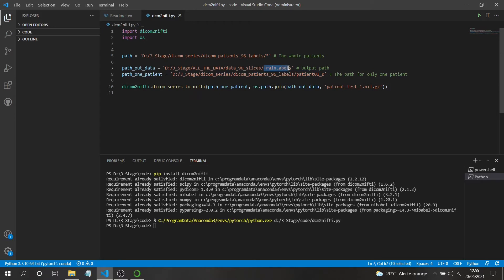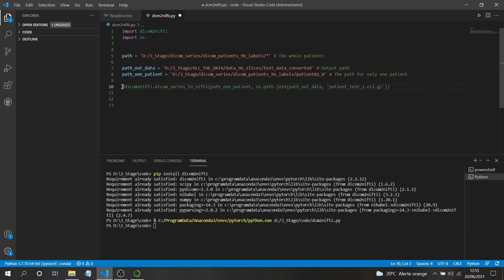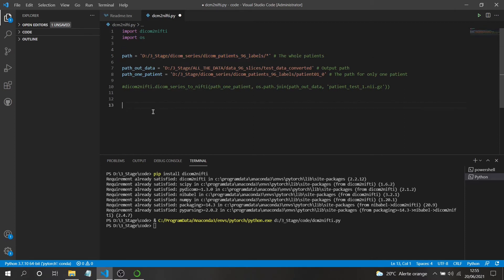I'll update the output path to the new folder we created. Now to build the loop, I'll use the glob function, which takes a path with a wildcard star — meaning all files or folders in that path — and creates full paths for each one. Let me first print what glob returns so we can see what we're working with.